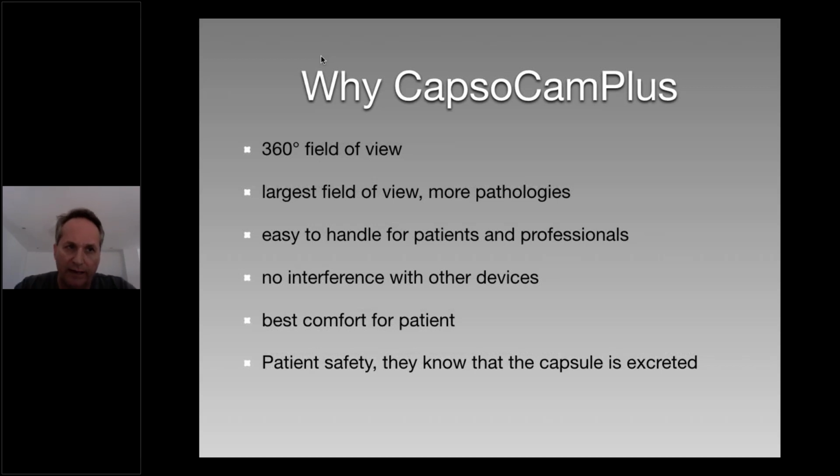It's also a kind of patient safety because we need the capsule back, as I told you, so every patient knows exactly that the capsule is excreted. You know it from the other systems with data recorders. There are often some patients who come in telling you, I can't find the capsule in the stool, I'm not sure it's out.